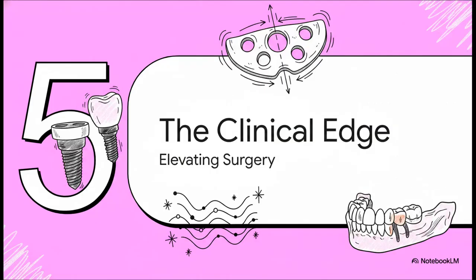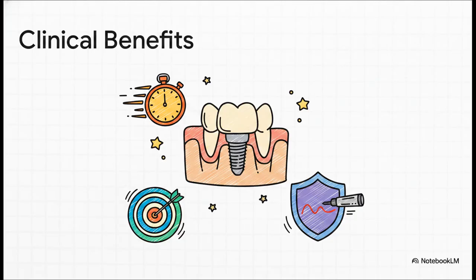Which brings us to our final stage, Stage 5, the clinical edge, elevating surgery. Let's talk about the real-world impact. Because all this technology and preparation is fascinating, right? But what is the massive real-world impact this tool actually has on surgical outcomes? Well, the benefits are frankly huge.